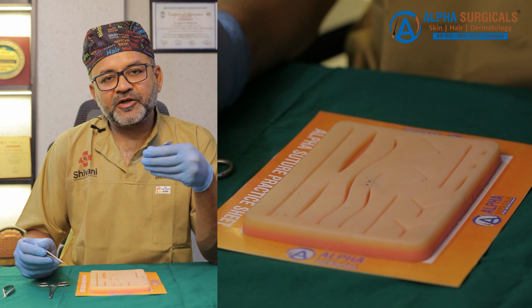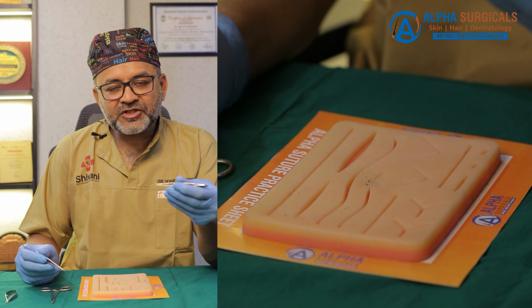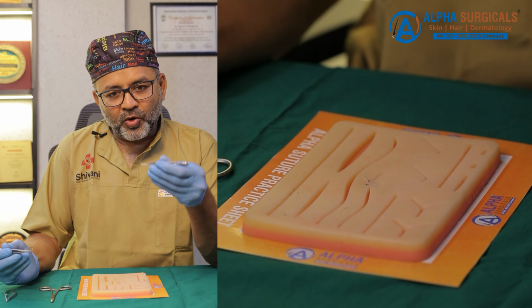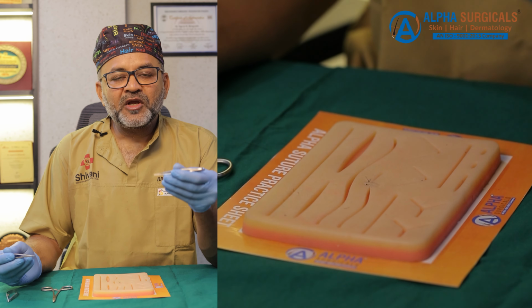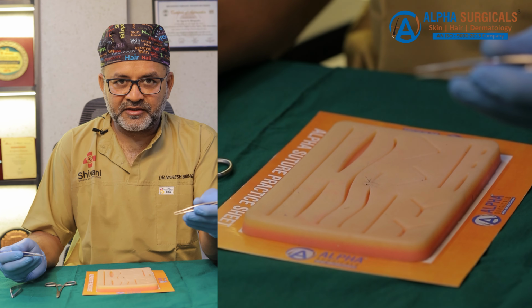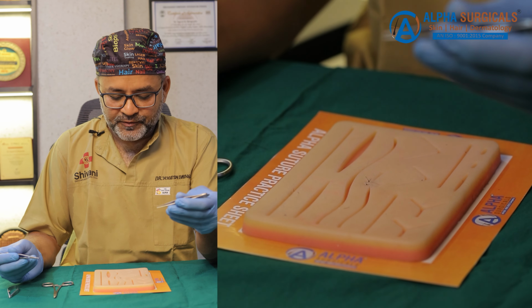So while we remove the cutaneous stitches, the intradermal stitches are still there and giving strength to the wound. So it will not allow the wound to get separated, holding the tissue for a longer time, so that a linear scar post-operatively will not happen on the surface. So this is the basic principle of putting intradermal stitches: to hold the tissue.